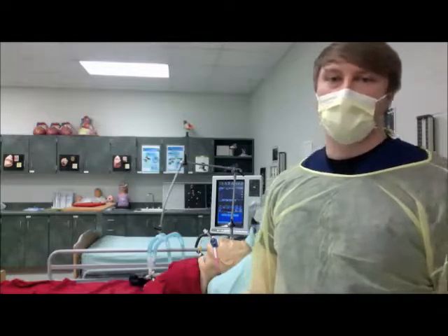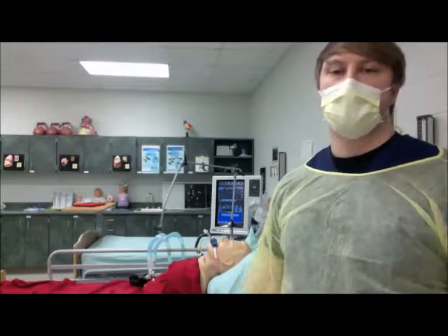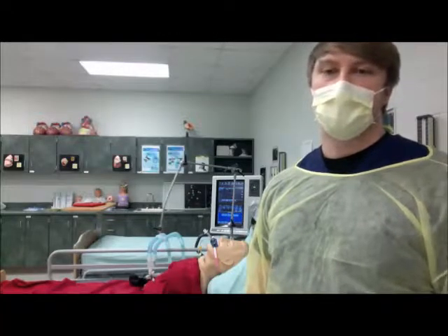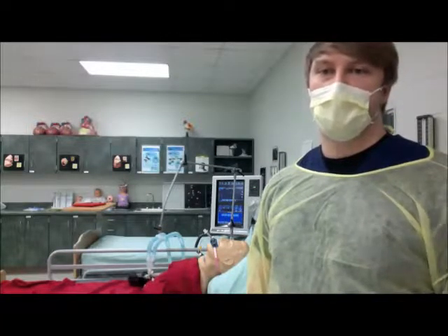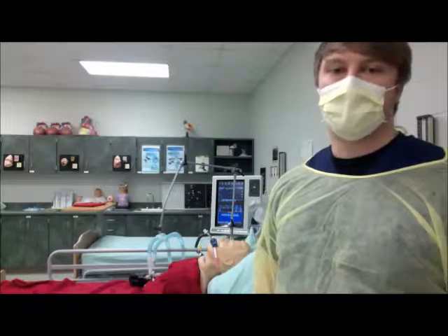So I come to Mrs. Tubbs' room and just found out that she's on contact precautions for MRSA in the nares. So we're going to take some extra precautions. But back to Mrs. Tubbs. So we successfully weaned her to an SIMV rate of 4 breaths per minute. I placed her on pressure support ventilation, so she's currently on a pressure support of 5 and a PEEP of 5, and an FiO2 of 35%.